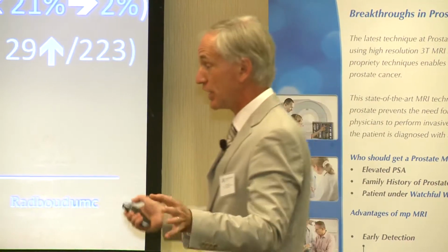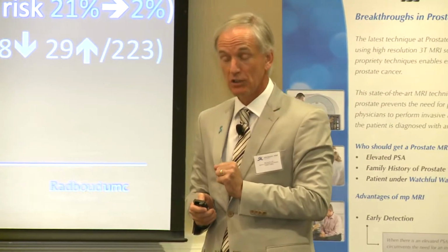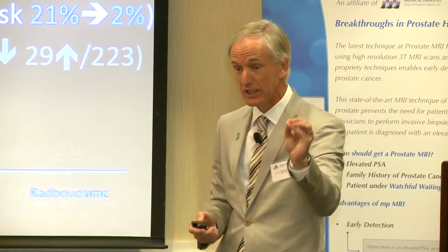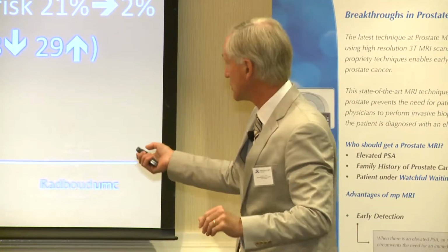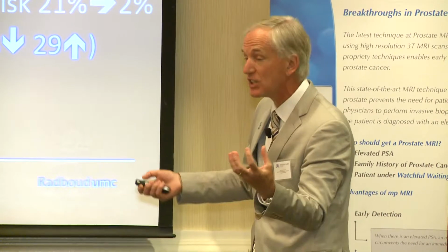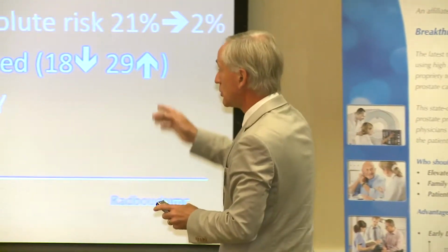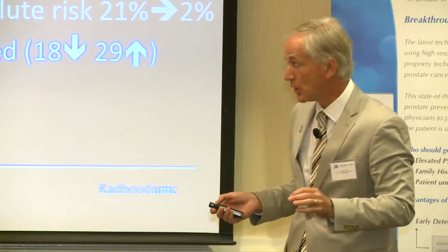Of course, urologists then will say, yeah, but you do not biopsy in PI-RADS 1, 2, and 3, so you will miss significant cancers. The answer is yes. However, the negative predictive value appeared to be 97%. And with TRUS biopsy, you miss more cancers. So the number of significant cancers detected even increased. The negative predictive value of TRUS biopsy is 71% versus 97% of MRI. So you detect even more significant cancers.